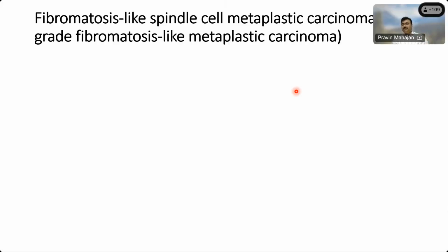This is a low-grade metaplastic spindle cell carcinoma. It's not high-grade metaplastic carcinomas, which are also triple negative. But this is a low-grade one, which is triple negative, and here there is no prior chemotherapy given before the surgery. This tumor will behave better, so they will directly go for the surgery. Okay, so that's the difference. That's why you have to write whether it's low-grade or high-grade. These are low-grade tumors, so you have to write it is low-grade tumor.